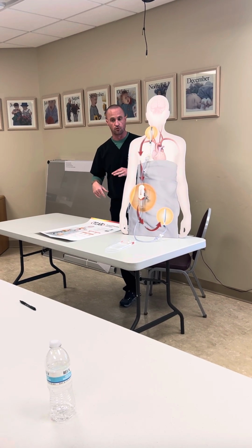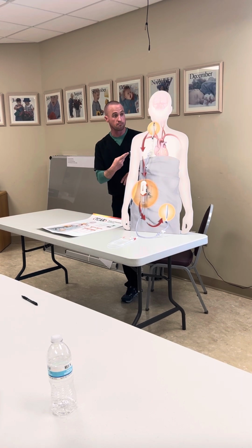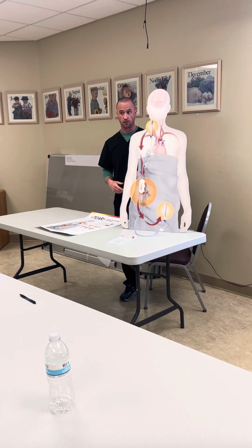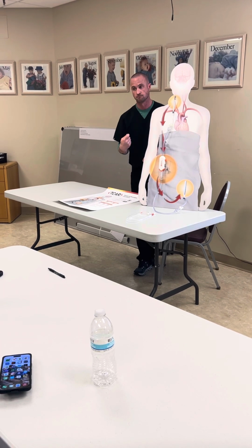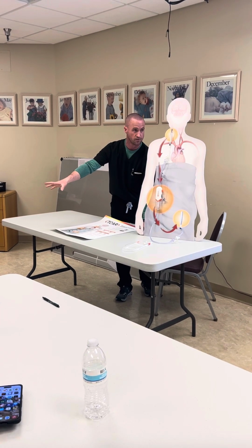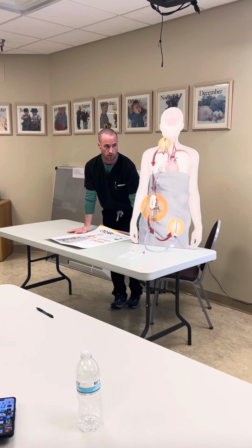But once we've approved everything as far as products on the table, all the requirements are met, we're then going to clamp. He's going to go straight up with the wire. He's going to go up with the balloon. We're going to balloon. We're up and down the balloon. Rarely are we up any longer than we need to be. And then once the balloon's out, we're up with the stent. And then maybe 30% of the cases will post-dilate. Usually it's calcific, and I'll have already opened a balloon for that post-dilation because we know all of those need to be post-dilated. Soft lesions and whatnot usually don't have to post-dilate.